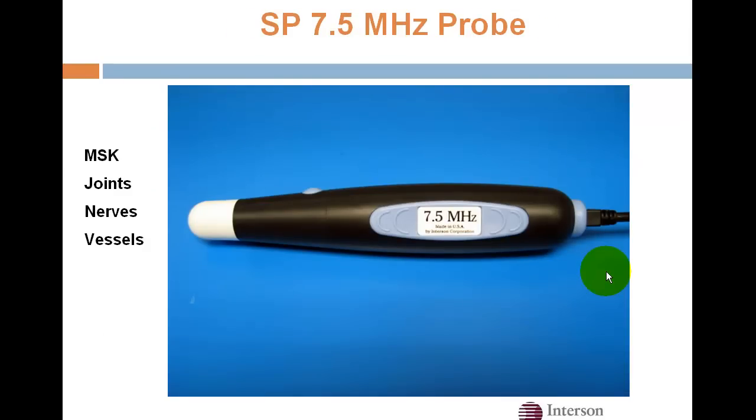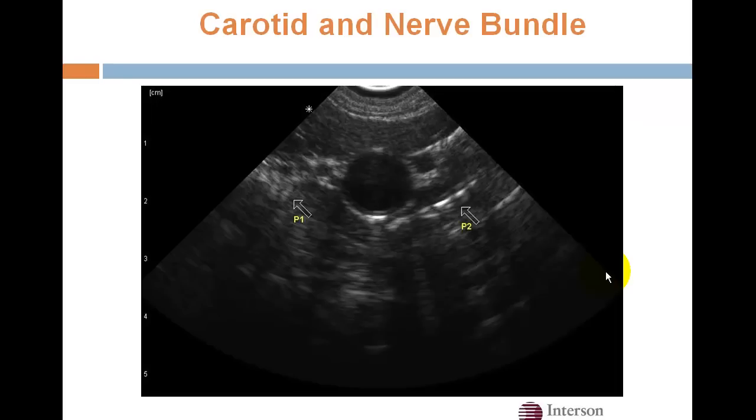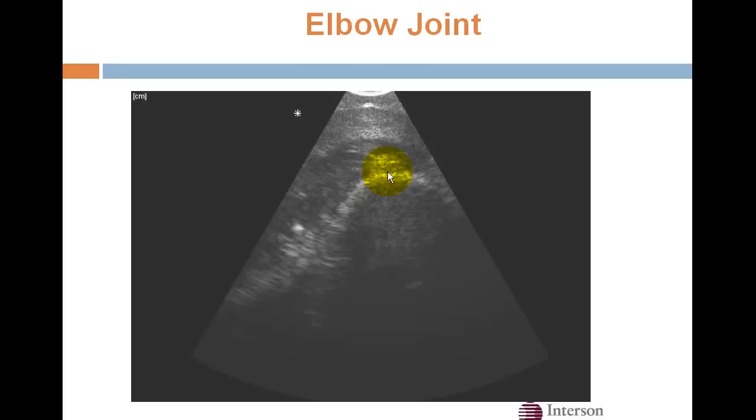This is our small-part 7.5 MHz probe, and it's ideal for musculoskeletal joints, nerves, and vessels. Here's the carotid artery, and here's an elbow joint.